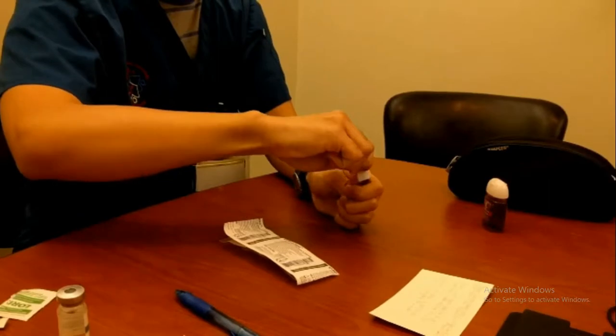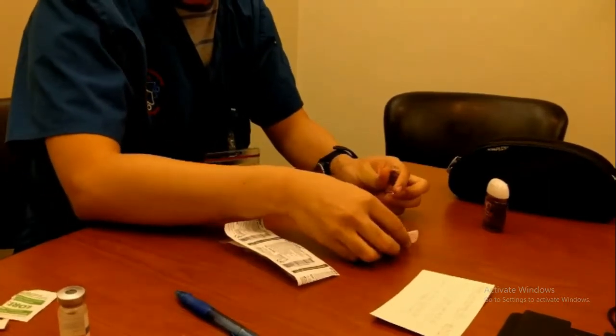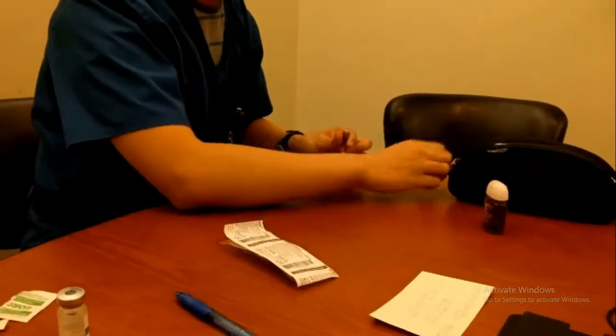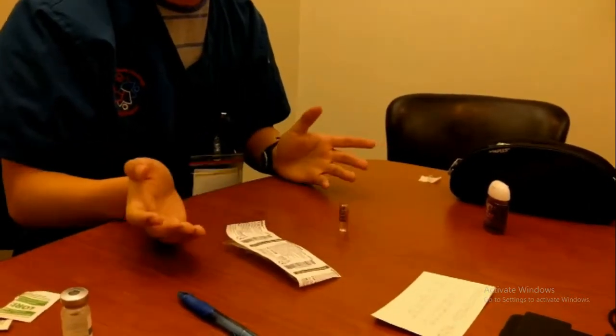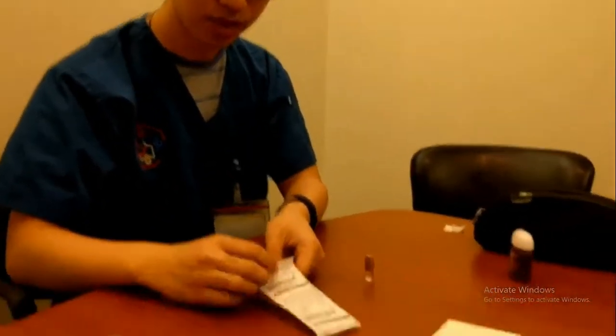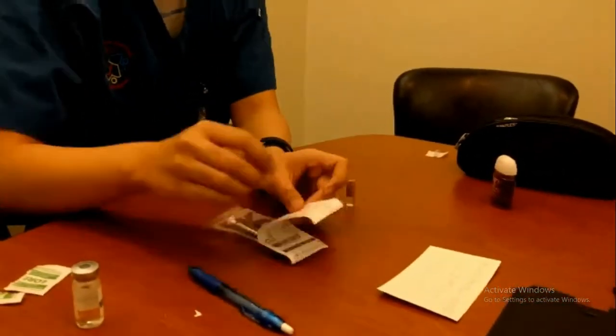So 1, 2, 3, there we go. And so that I will dispose of in the sharps container. We don't have one right now, but in the clinical setting, I would have put it in the sharps container.